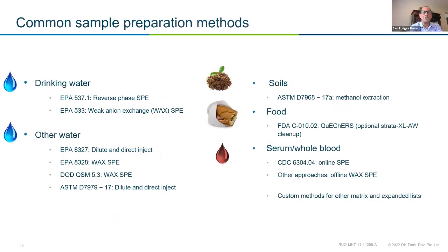So there's a whole lot of different PFAS methods, a lot of them by matrix, as well as, of course, the different matrices.